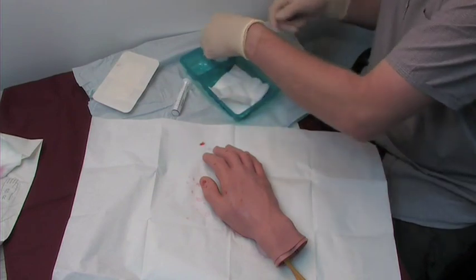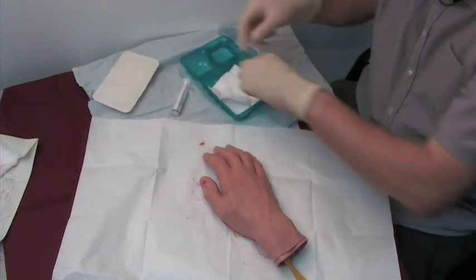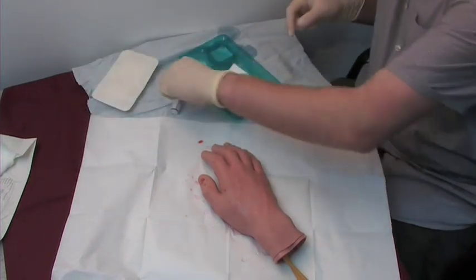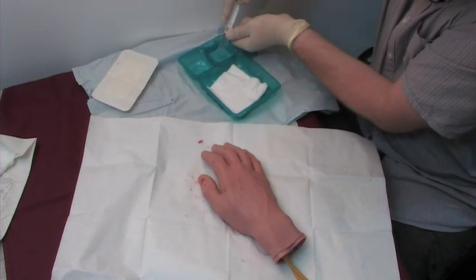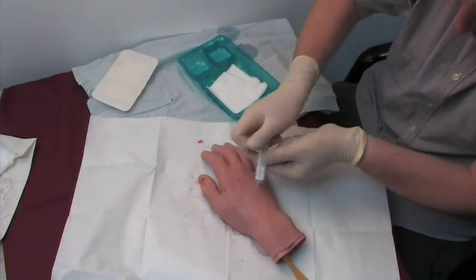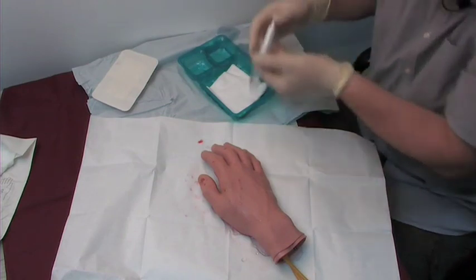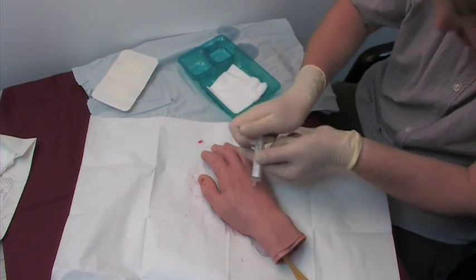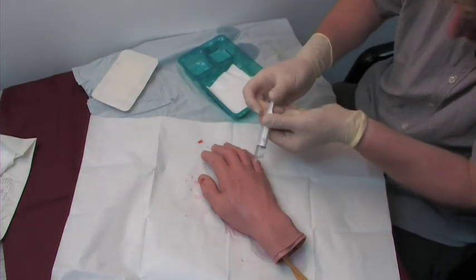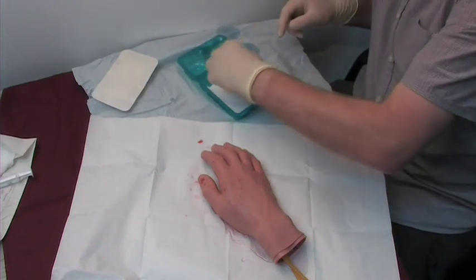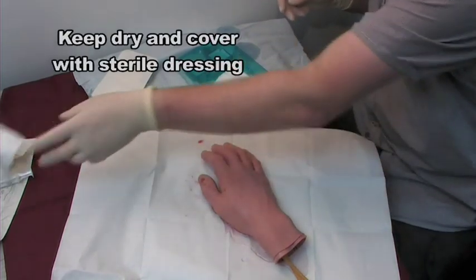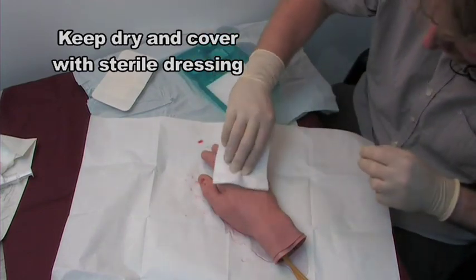For the wound, picking up with my left and using my right just to give it a wipe over. Picking up with the left, using the right just to get the surrounding tissues nice and clean. Then for the actual wound itself, I'm going to draw up the sterile saline and just flush the wound. It's been caught on the drape below. Continue this process, just flushing the wound out, making sure it's nice and clean. You continue this until you're happy or until all your solution's been used. When you've done that, discard and then use the remainder of the gauze just to dry the surrounding tissues of the wound, so they'll be ready for the plaster to be applied.